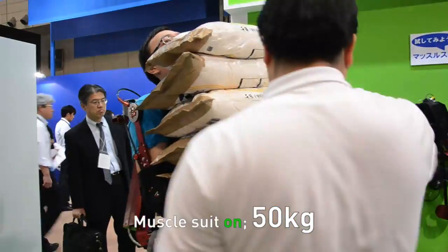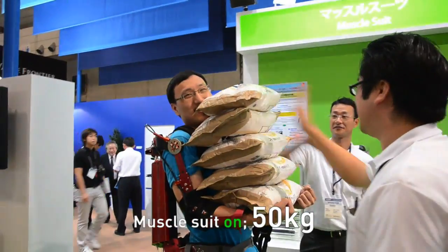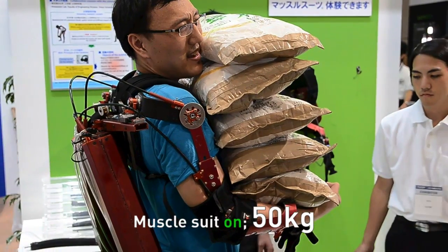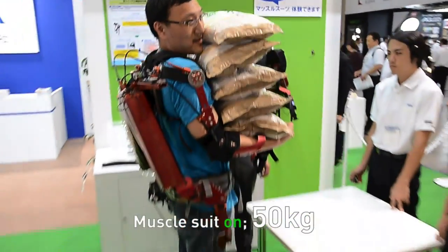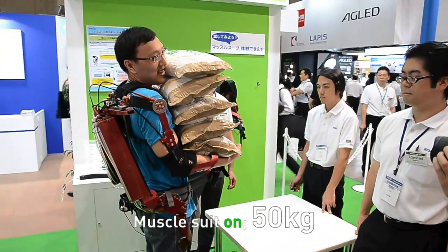Can you dance a bit? Not really. How do you feel? It's actually very heavy on the legs. I could hold it with my arms, but my legs are saying it's heavy.